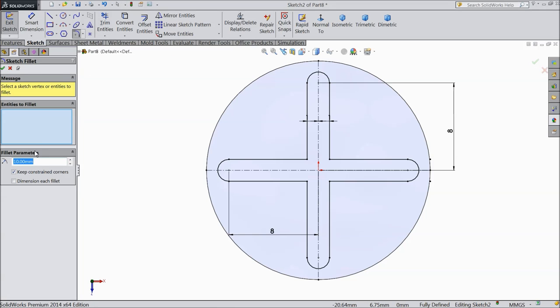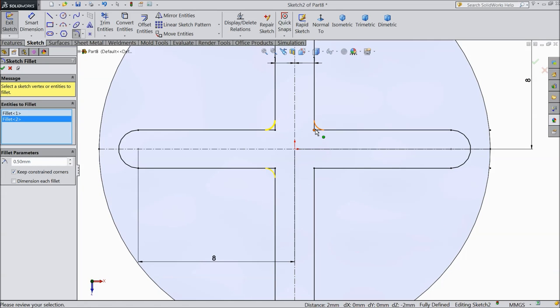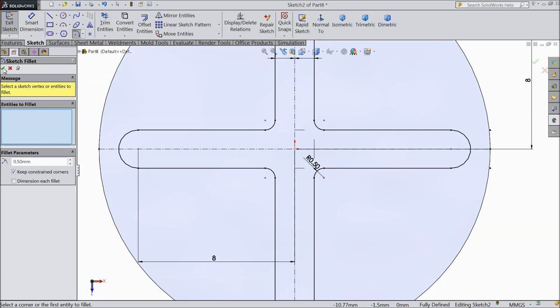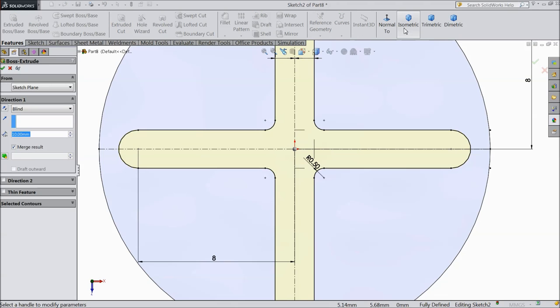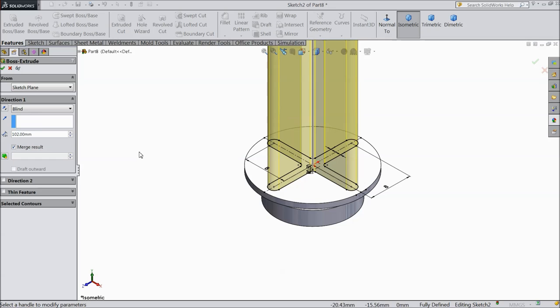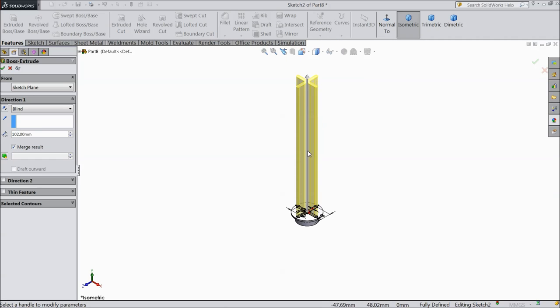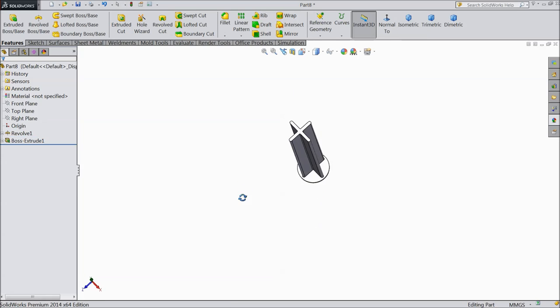Now choose fillet and make 0.5mm. Select these 4 corners. Now we will extrude it — select extrude and make the height 102mm.